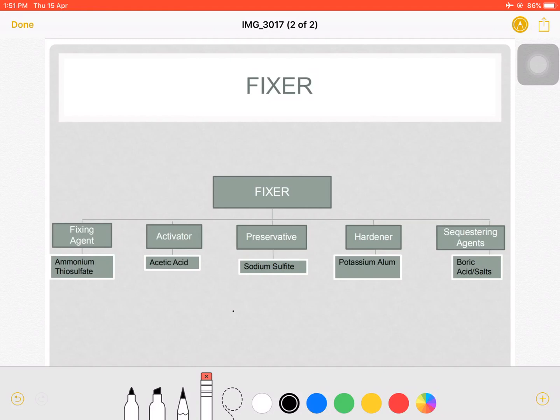Okay, kaya ang ating fixer solution, minsan may bumibili nan sa mga departments, sa mga hospitals, or x-ray facilities. Dahil yung silver na nagko-contain sa ating film is yung silver na isinusuot na alahas. Okay, so meron tayong mga process on how to get that silver from a fixer solution.